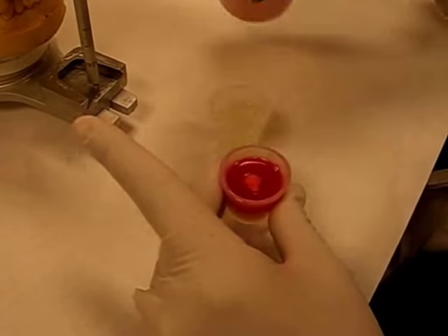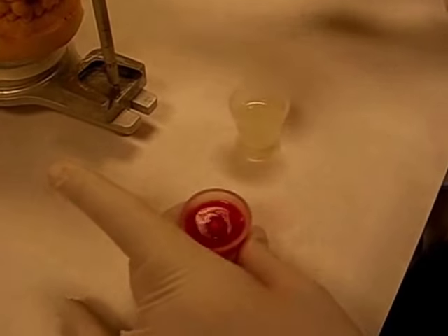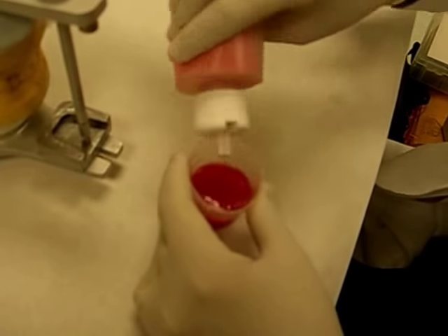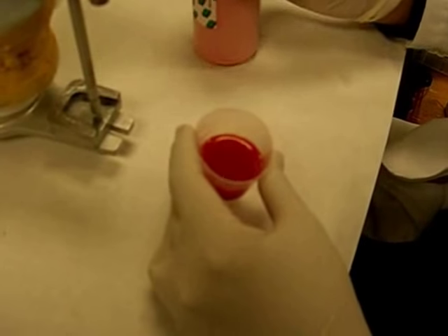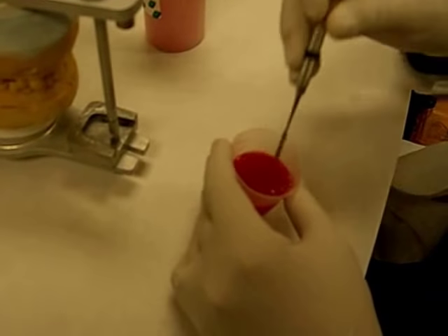We incorporate the powder into the monomer to make sure it flows out properly. Make sure you use Vaseline on the pin as well as on the table to be able to remove the acrylic from the table.